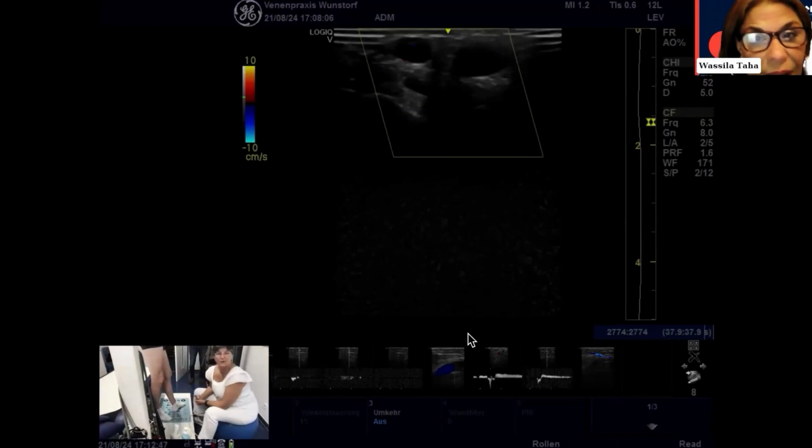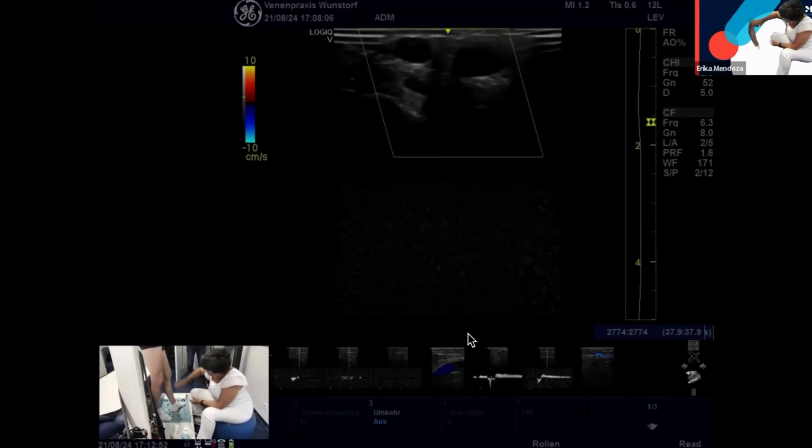So now again, please. Yes, we have a male patient with varicose veins here. There are some varicose veins, but if you touch, it's very clear. You can touch the greater saphenous vein there because there is really no fat. And you start here. Just have a look, but without complaints.